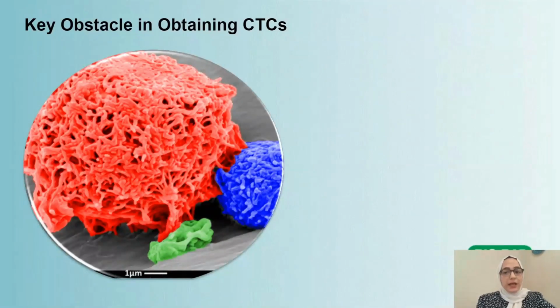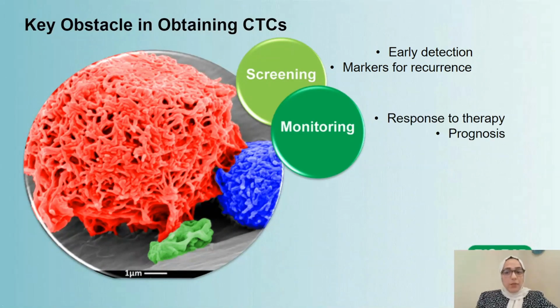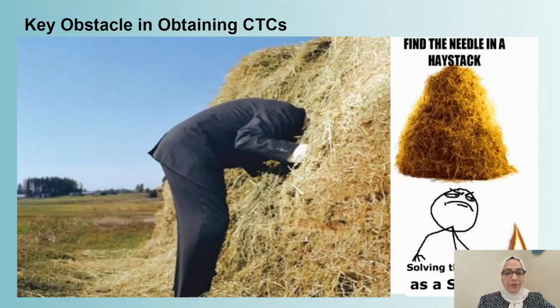CTCs are challenging to capture, but they remain highly desirable as biomarkers since they are useful for screening for early detection and tumor recurrence, monitoring for response to therapy and patient's prognosis, as a real-time biopsy since it's minimally invasive and repeatable, and personalizing medicine by identification of targets and ex vivo therapeutic targets.